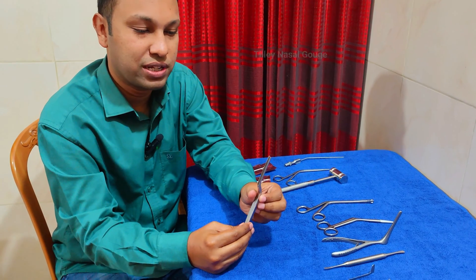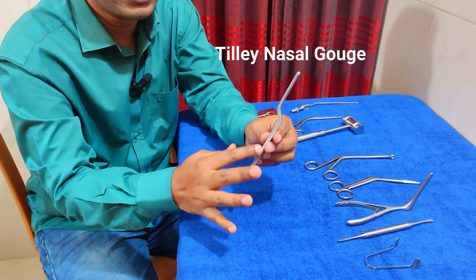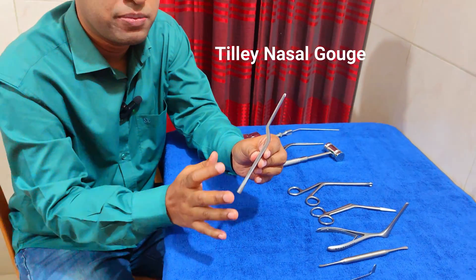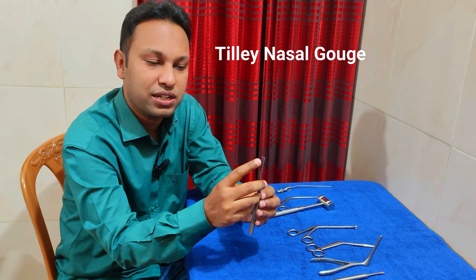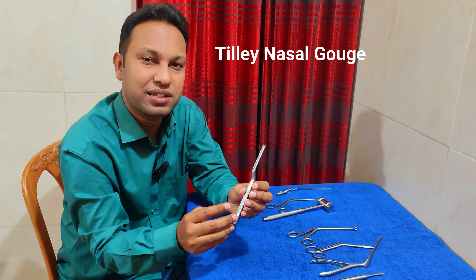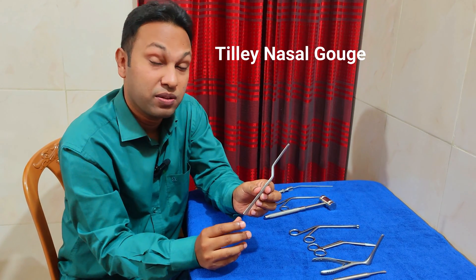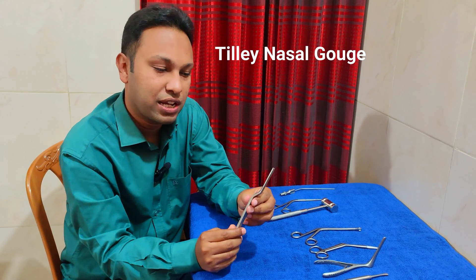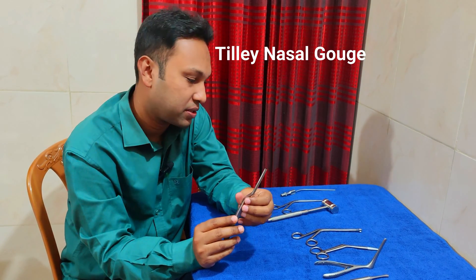This is known as the Tilly nasal gouge. It is bayonet-shaped, and at the tip it is V-shaped. It is V-shaped for engagement into the maxillary crest, and it is bayonet-shaped for better visualization. It helps us to remove the maxillary crest and septal spur.